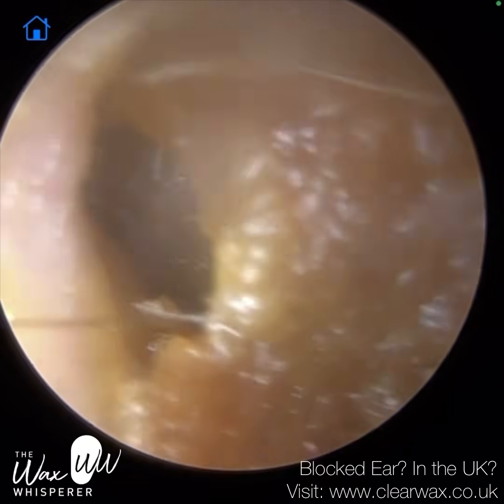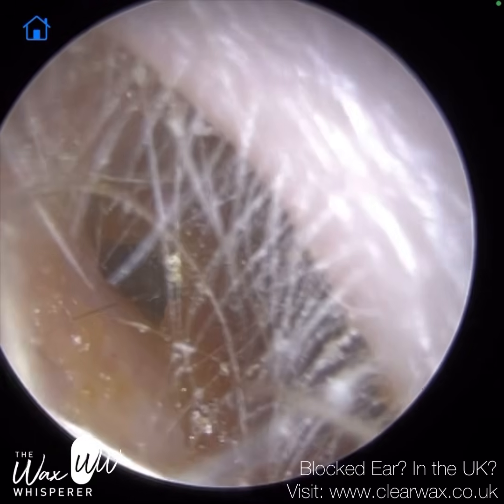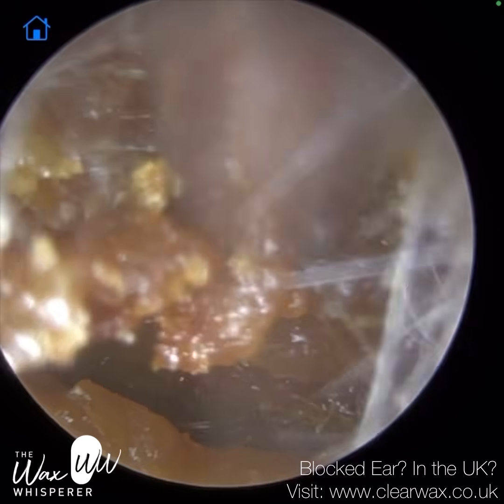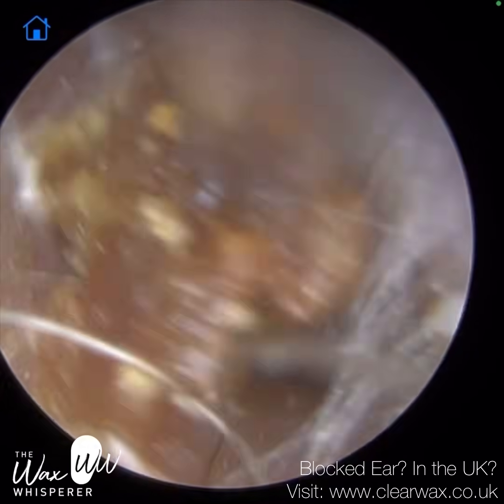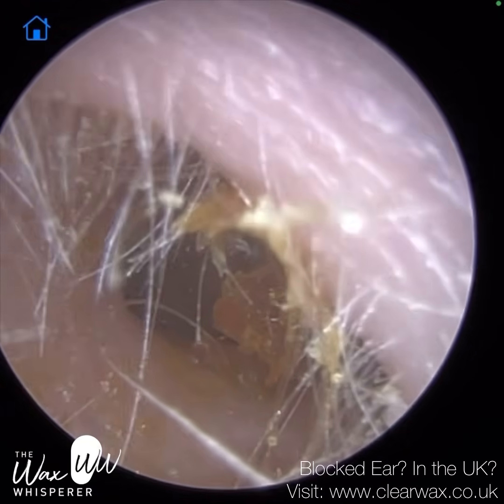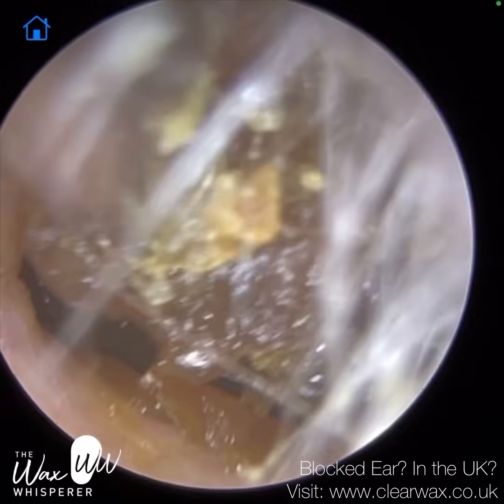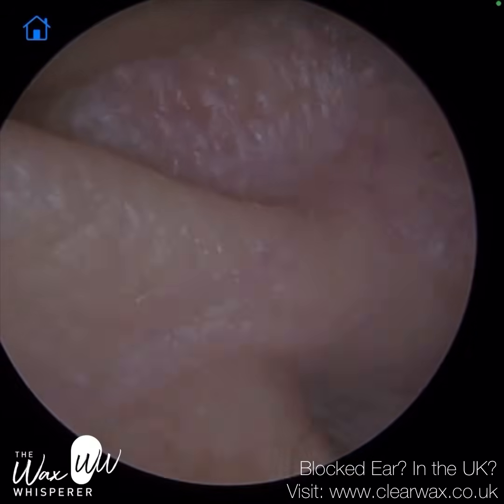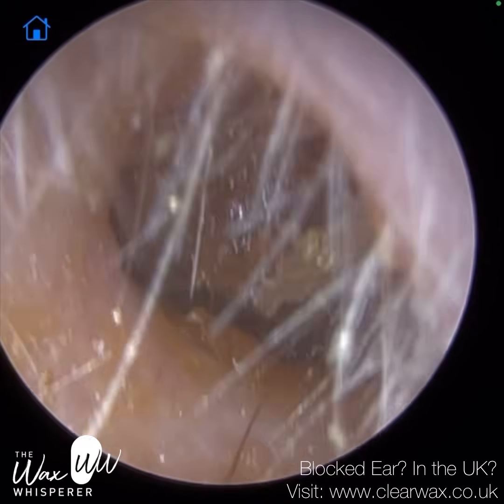So this is patient 2, and this is of their left ear. And similar to patient 1, this wax plug extends all the way from the entrance to the eardrum. They also have a lot of hairs at the entrance of the ear, but they're not as matted into the wax as patient 1. So the wax is a bit sticky, and I'm just taking away the more lateral surface of wax there. And the idea is to just detach it from the floor of the ear canal and slowly wriggle it out. See, the wax is separating into little bits.